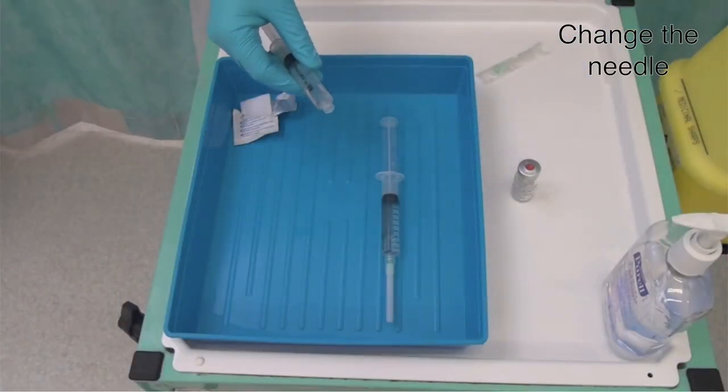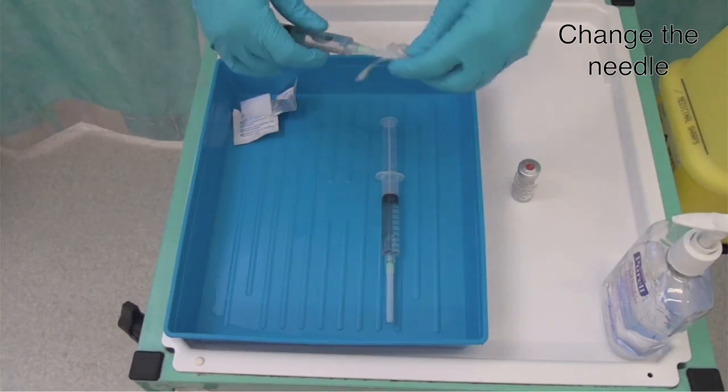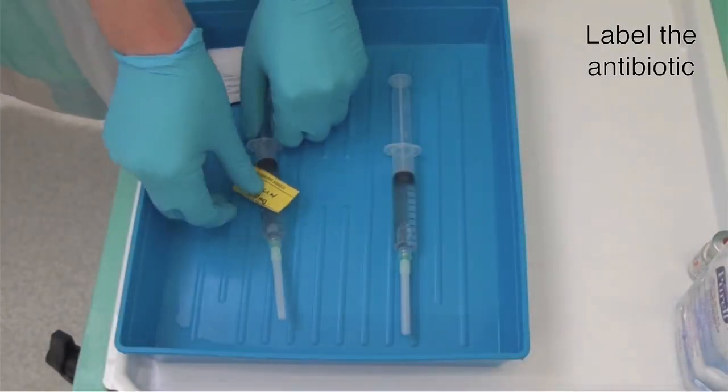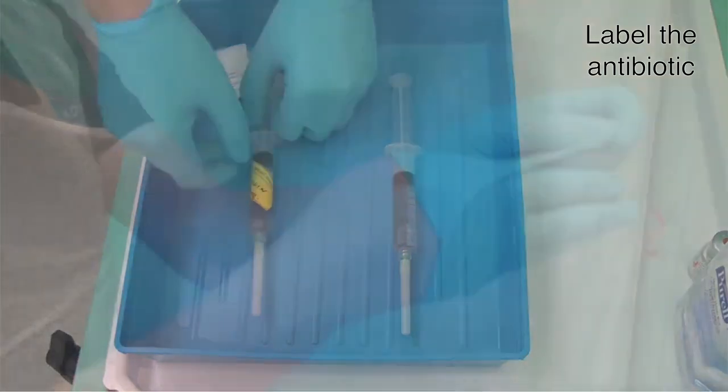Change the needle at this point to avoid resheathing. Importantly, label your antibiotic syringe now so you know which is which.